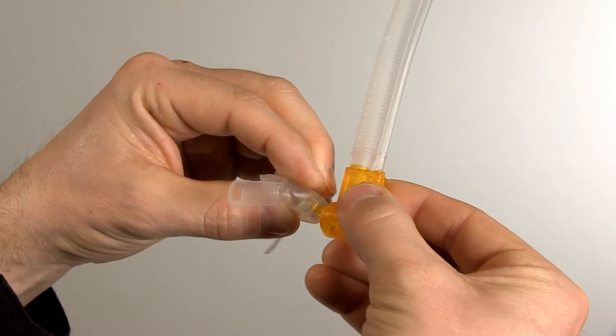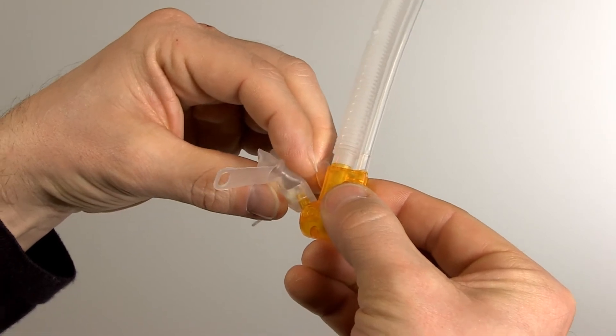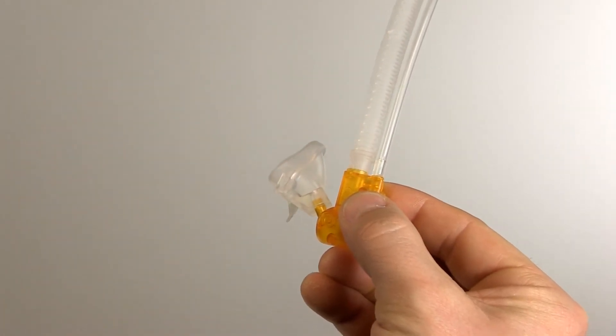Mount the mask or prongs on the NC-PAP generator. Please note that the angle at which the mask is mounted on the generator can be adjusted if necessary.